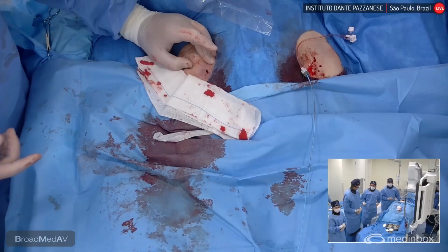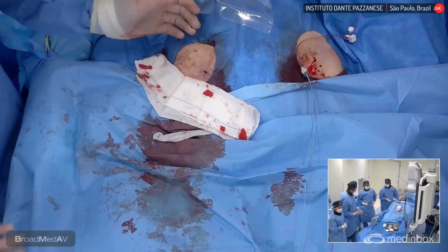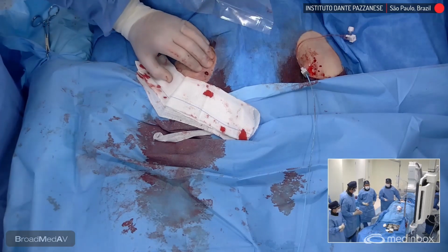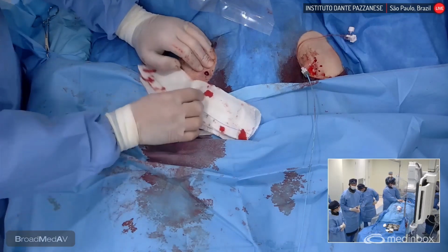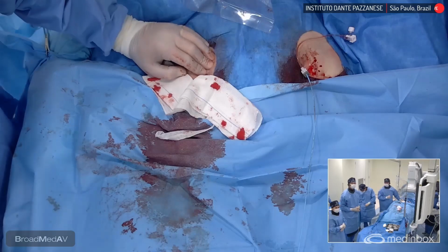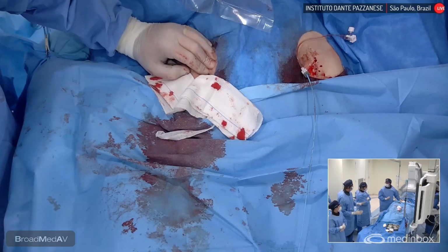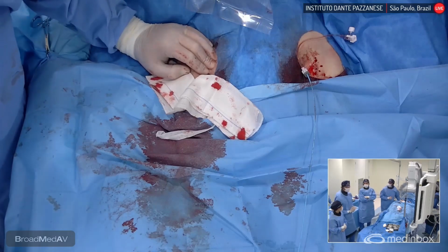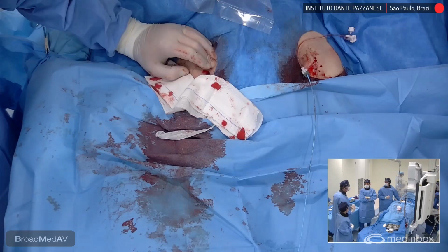So it's great. Is it still bleeding? No, just a little bit from the skin, I think. I usually like to compress for 3 to 4 minutes, and then we can perform a control angiogram. The patient maintained his blood pressure after we took off the sheath. The procedure is finished. So it's now 45 minutes since we started.